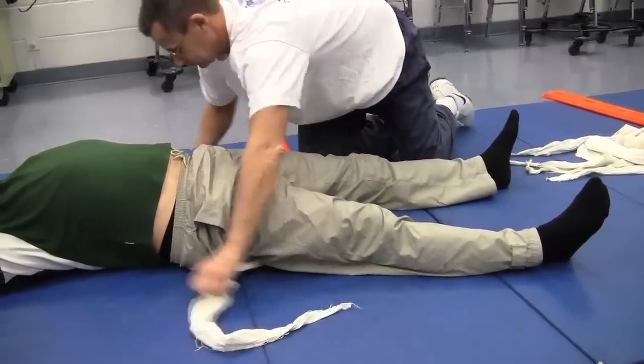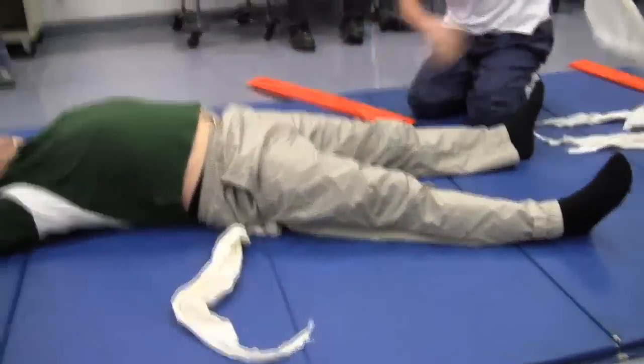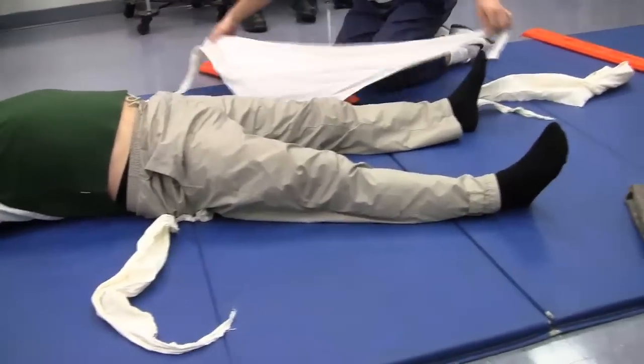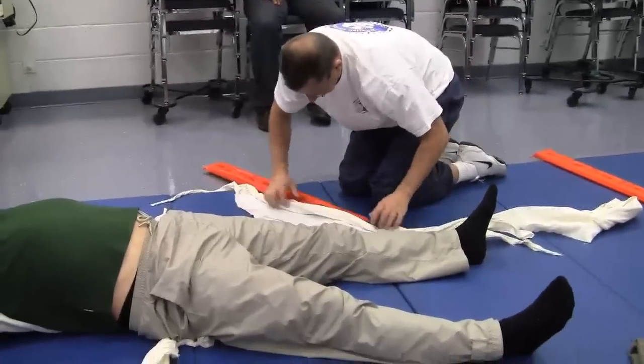Take this one, and that one up to about right there. In the state test, remember, we don't flip or turn. Just roll it around like so.